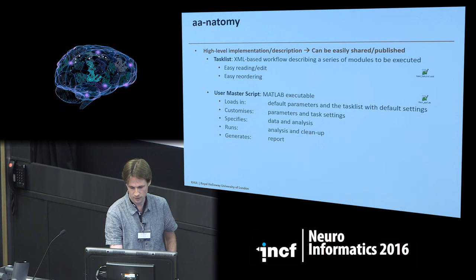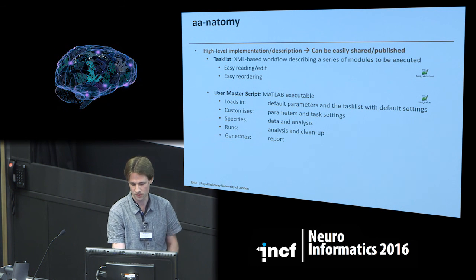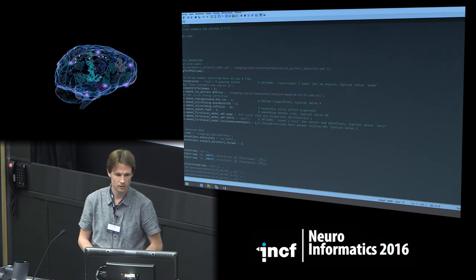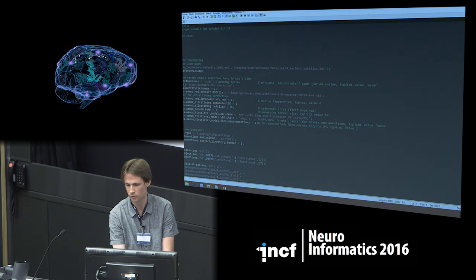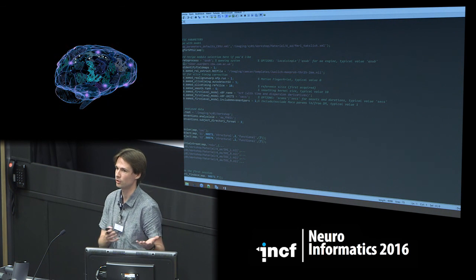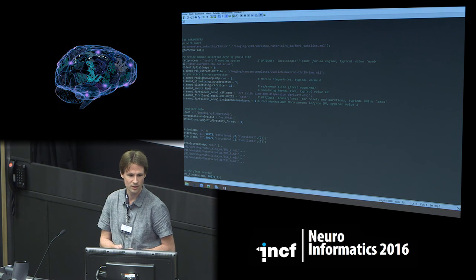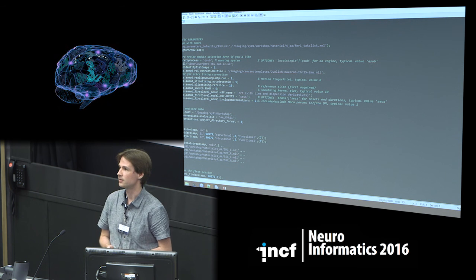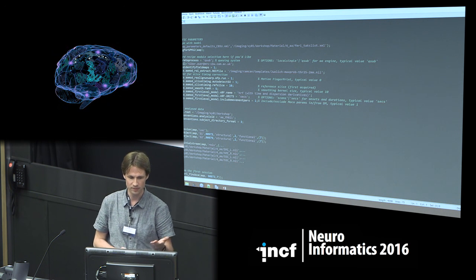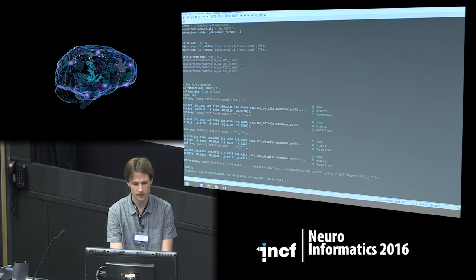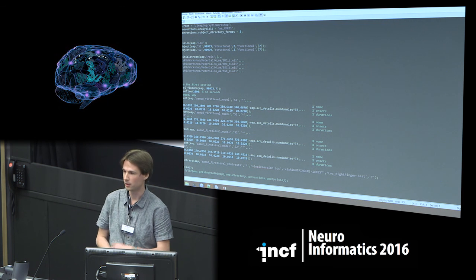The other file is the actual MATLAB script — the user master script, which is the MATLAB executable. First it loads up the task list and the configuration settings. Then you can modify the default settings stored in the XML files — for example, a different smoothing or a different basis function for your model. Then you specify where you want to put the analysis, add the data, specify the model, and run the analysis.